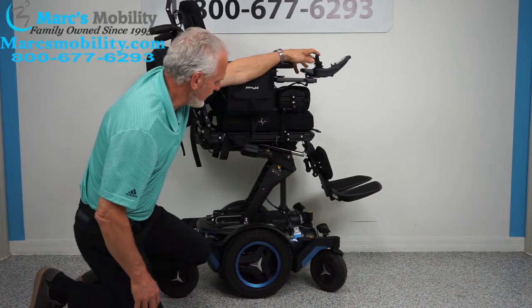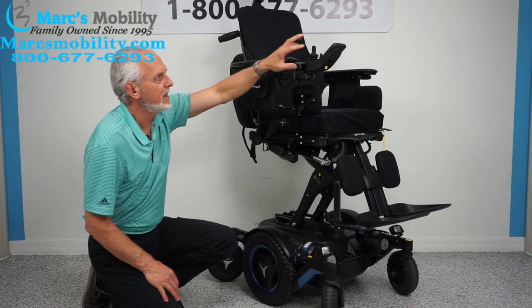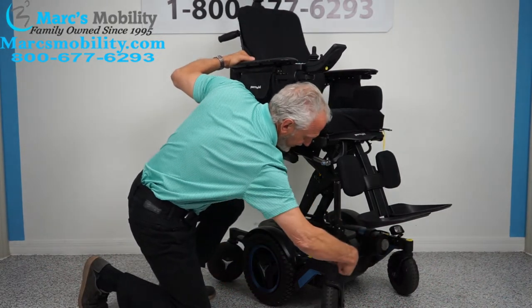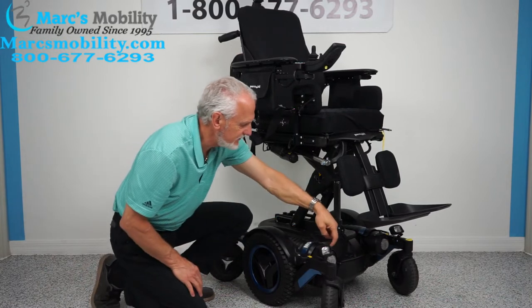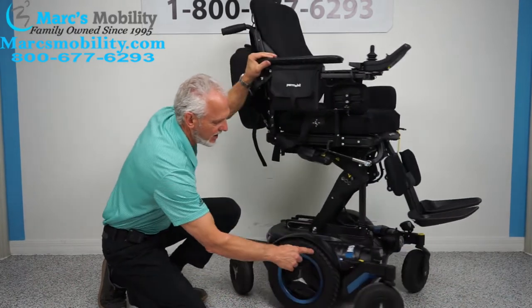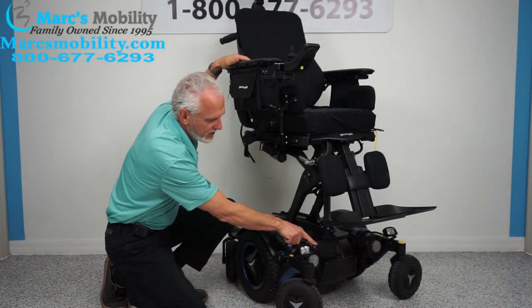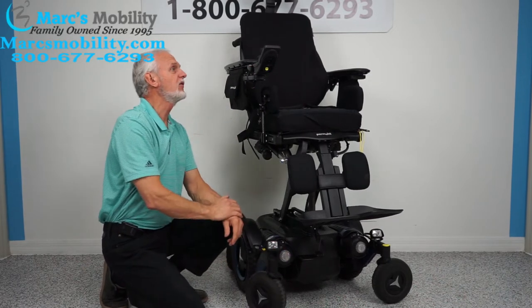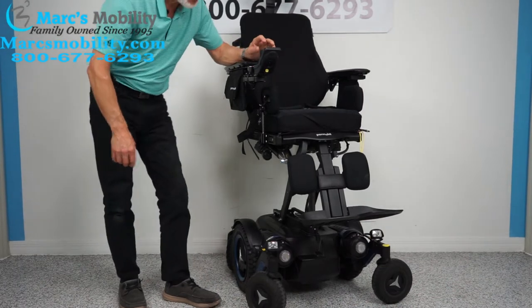If you need to push this chair manually — hopefully you never have an issue — these are your motors right here. Right on top of each motor there's a little silver handle. If you push that handle inward, it unlocks the drive wheel. You have to do this on both motors. When you want to put it back in gear, push it back. You want the power off so there's no resistance in the motor while pushing it around. Those are your neutral levers.